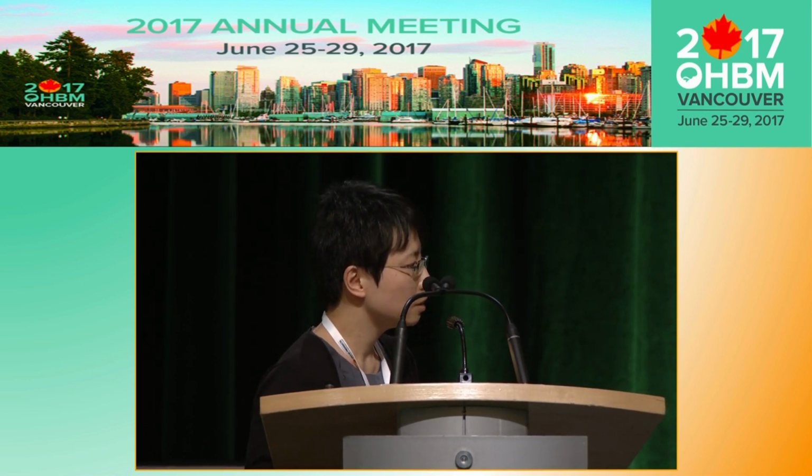I'm familiar with this sort of thing in the context of fMRI. One of the things that you find when you're cleaning up fMRI data is that a classifier that you train on one data set is not necessarily generalizable to data that's acquired with a different protocol or in different populations. How do you expect that to behave in EEG? If I have trained on a large number of channels, can I just use that classifier on data that has different properties?